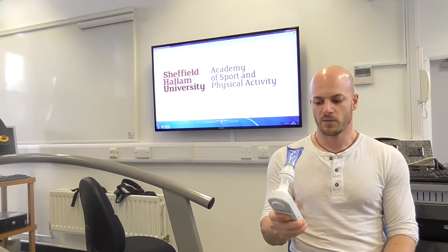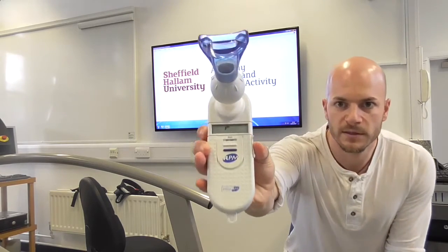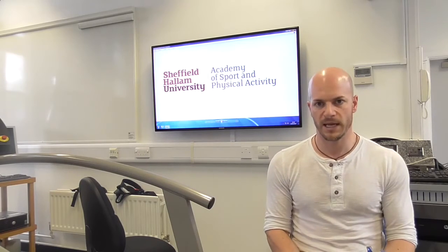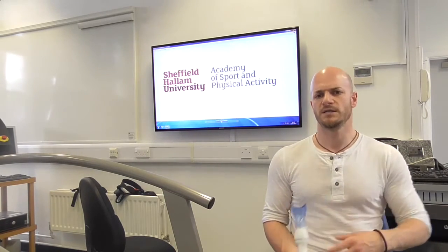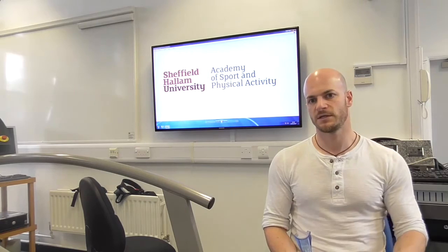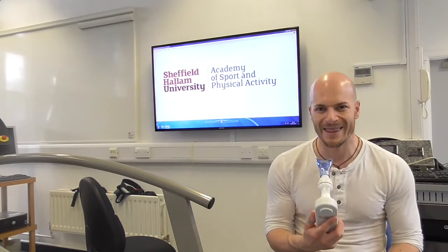I'm going to hand you the handheld device. You switch it on and wait for the display to say zero — the little beep means we're ready to go. The inspiration maneuver is performed from empty lungs. So the first part is to breathe out and empty the lungs as much as you possibly can. When the lungs are completely empty, the mouthpiece goes in and you're going to pull in as hard as you possibly can. This mouthpiece is going to be occluded — meaning hardly any air will flow through — which allows you to generate high pressure. Pull in as hard as possible for about five seconds and see how much pressure you can generate.